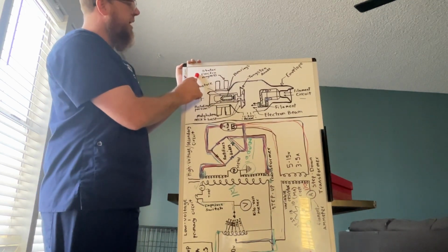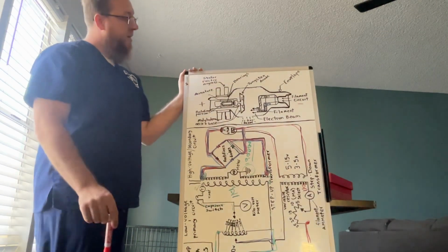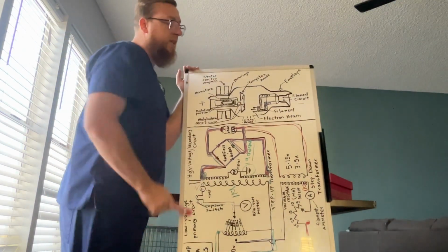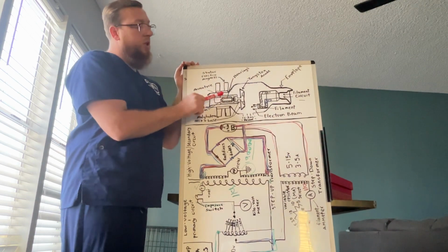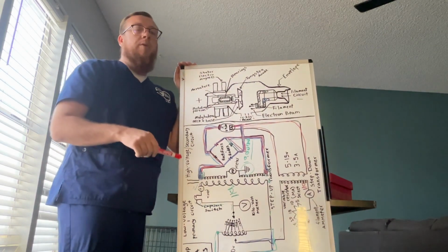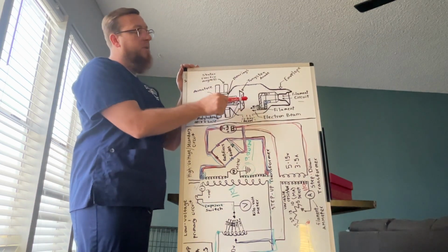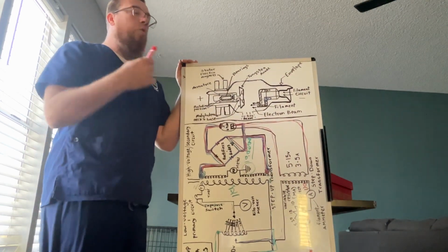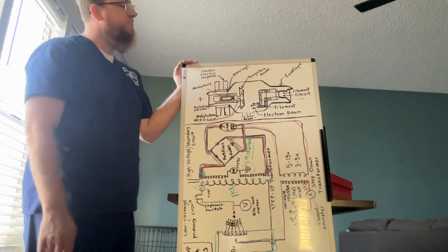We have our stator electromagnet, which is going to help our rotating portion start to spin. And there are 6 points of induction happening in this whole section, and I'll come back to that, but this is one of them. Once the rotating portion starts to spin, the stator electromagnet will induce the rotor inside of the stator to spin even faster. And what that's going to do is spin the anode plate to a high speed. That's going to help with cooling off and directing electrons down as much as possible.